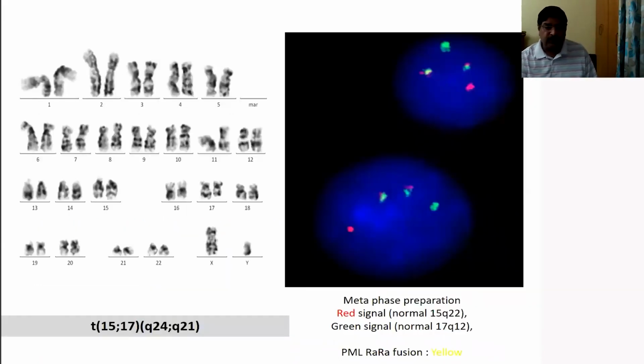So this is acute promyelocytic leukemia. As I mentioned, you have the promyelocytic morphology. Like the last case, number 5, your TLC count was 800. Classical promyelocytic leukemias are leukopenic. They will have a count which is subnormal, and you will find abnormal promyelocytes. And when you do a marrow and do the flow cytometry, you have those characteristic features. But if you do the FISH, then you will find the t(15;17) translocation. Again, you can find that there is a fusion signal here.